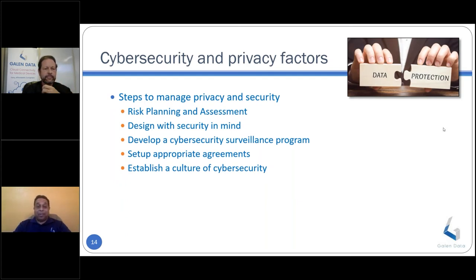Audit trail, something that's required by a lot of these regulations. How are you going to know who did what change when? Those kind of things. Doing things like security testing, just like you do functional testing to make sure your device works. You may do stress testing. You may try to break your devices by throwing it 1,000 ways.